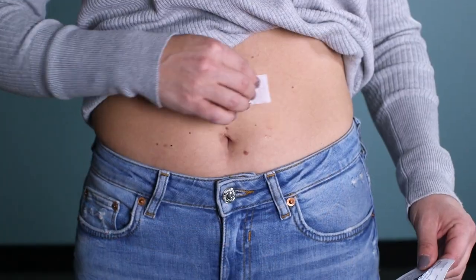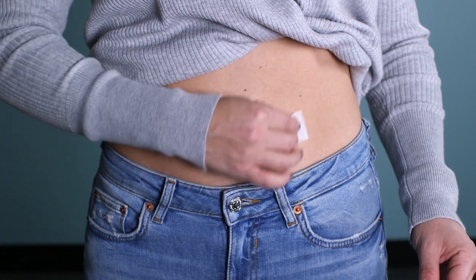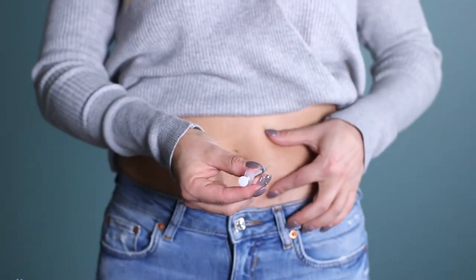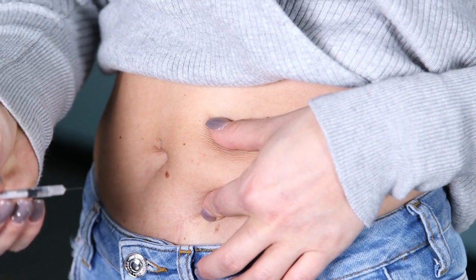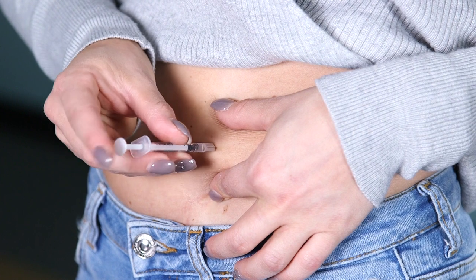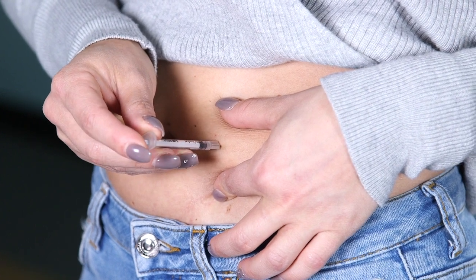Alcohol wipe the skin on the abdomen where you're going to receive the injection. Let the alcohol dry. Hold the syringe like a dart. Squeeze the skin. The needle goes straight in at a 45 to 90 degree angle. Depress the plunger.